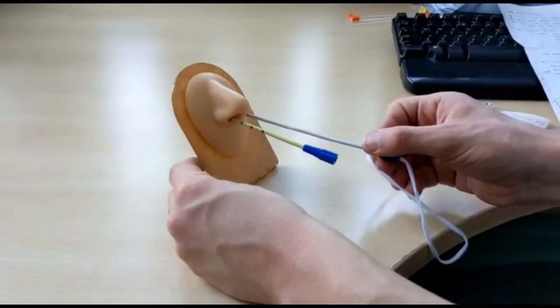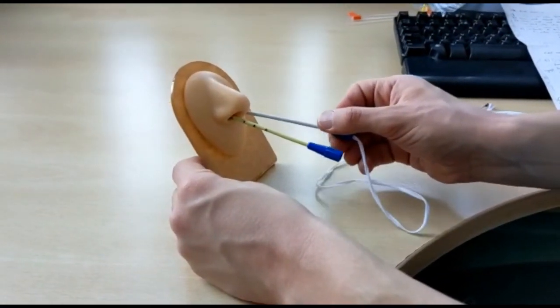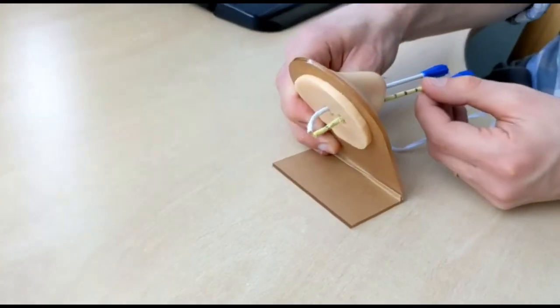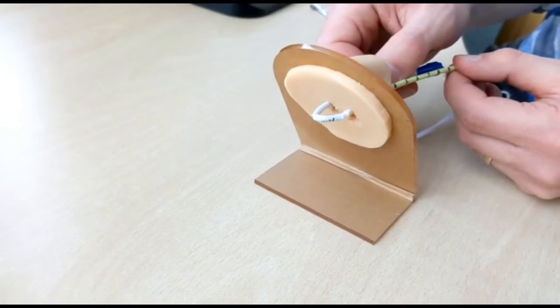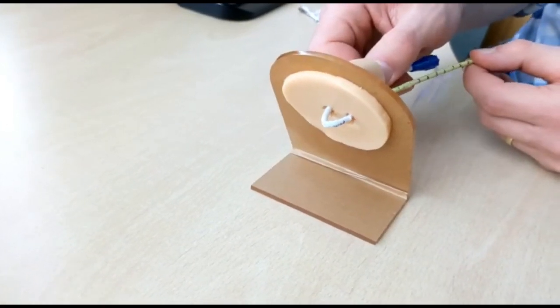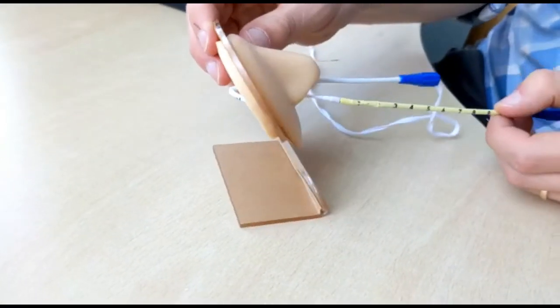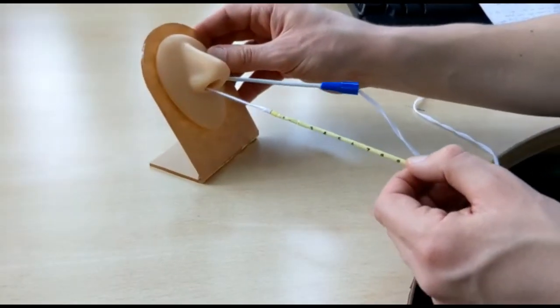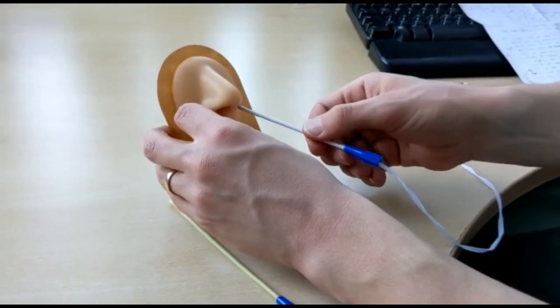Estimating the correct depth is usually a matter of trial and error, although the depth is usually greater than 5cm. Once you feel they are connected, lightly pull the yellow pole out and the white string will follow. You will now be left with the string anchored on the vomer bone.